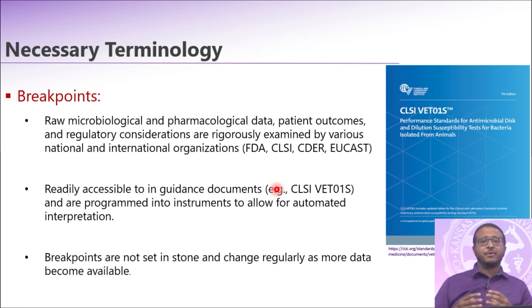All these aspects, all these pieces of information are being examined and carefully revised by national and international committees before even these breakpoints make it to a publication and become available for us.